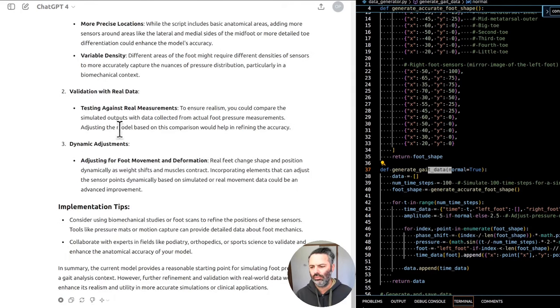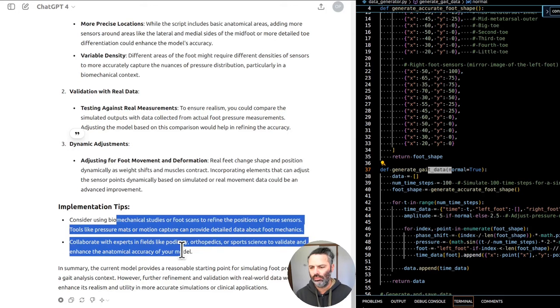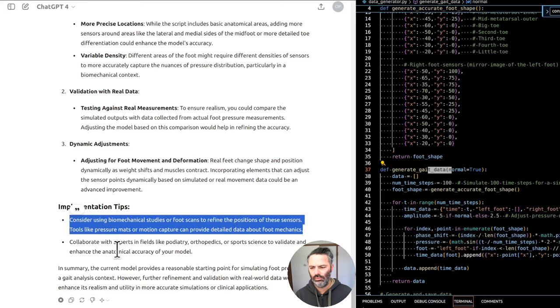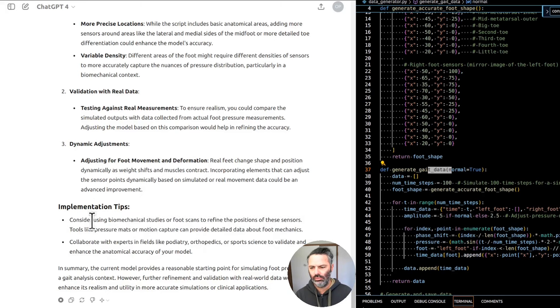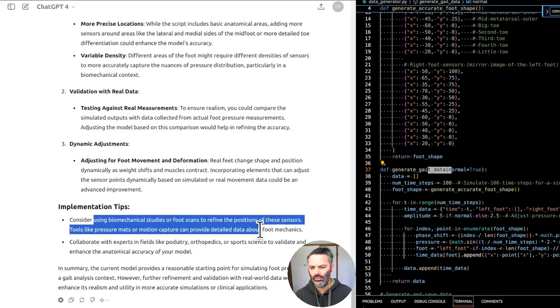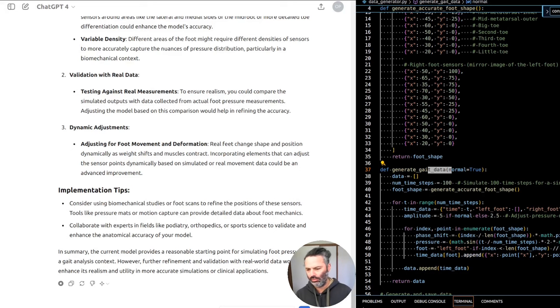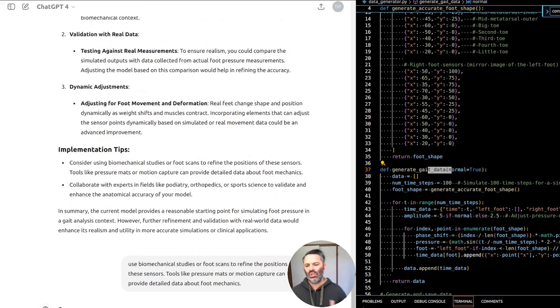Arch points. The inner and outer arch points are essential for tracking the arch's collapse or elevation, especially in dynamic movements or in individuals with flat feet or high arches. Metatarsal points. These are positioned to track pressure across the ball of the foot, which is significant during the toe-off phase in gait. Toe points. The inclusion of multiple points for different toes helps in understanding the distribution of pressure across the toes, which varies significantly in normal versus abnormal gaits.